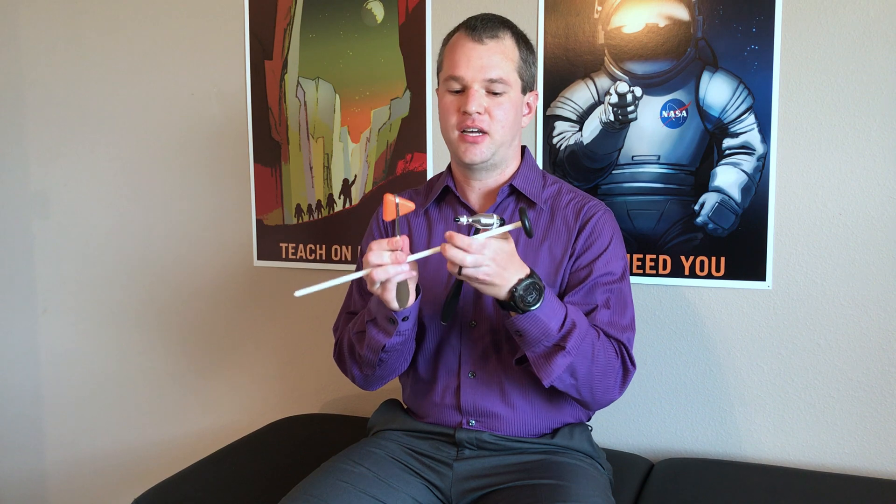Thor's hammers or reflex hammers? Which one's which? Actually, I don't have access to Thor's hammer, but I might have a few reflex hammers.